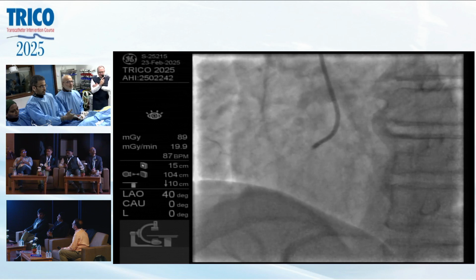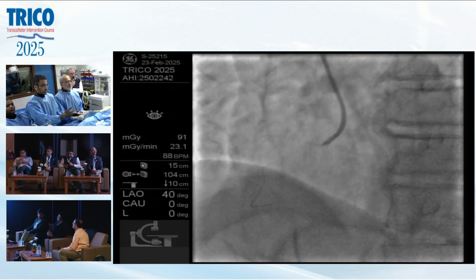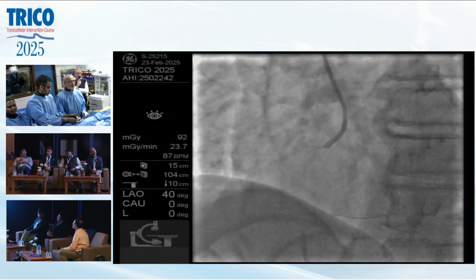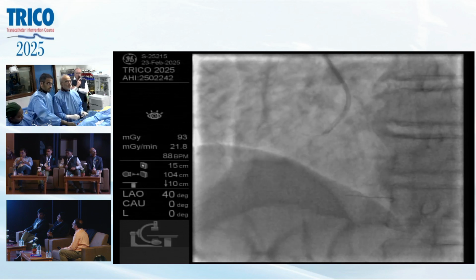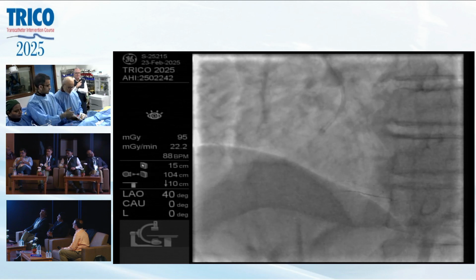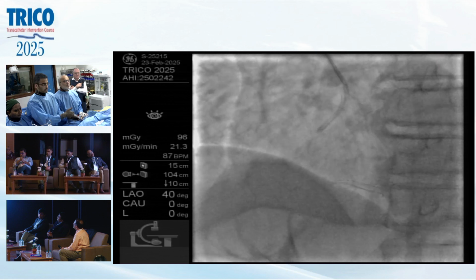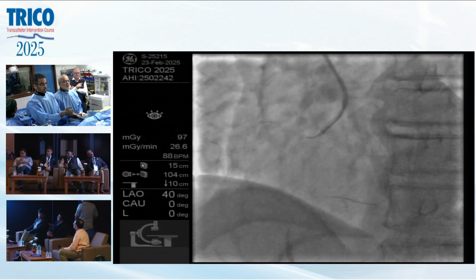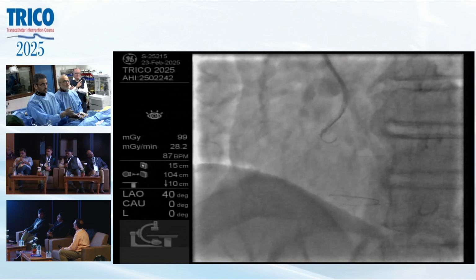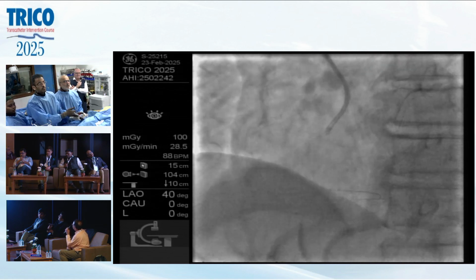The other approach that some people use when they're really having trouble with these, just like any other intervention, is again use of guide extensions if you do not have a stable guide position. Yes, you are right. Almost there. You're in. There we go. Okay, you're in.